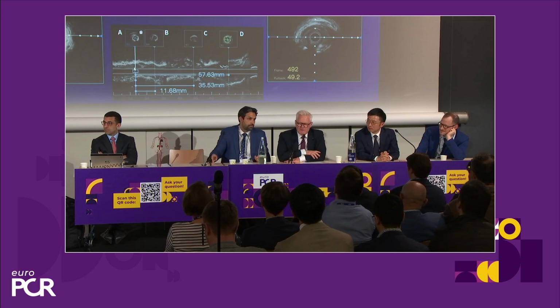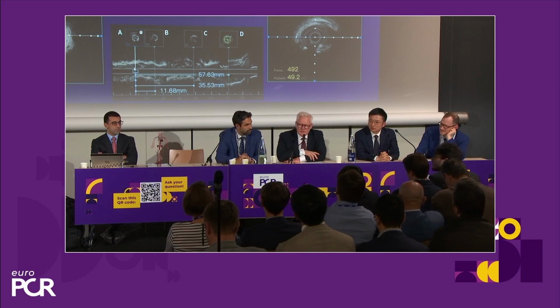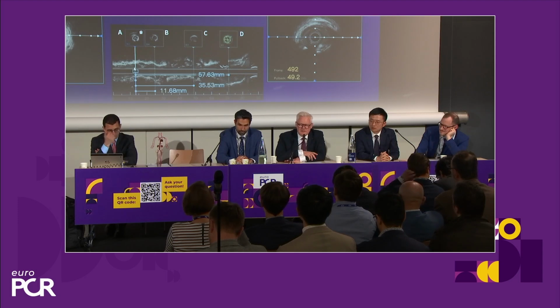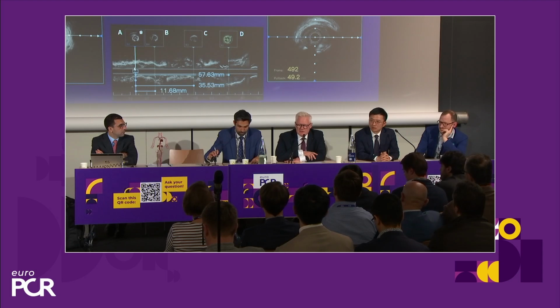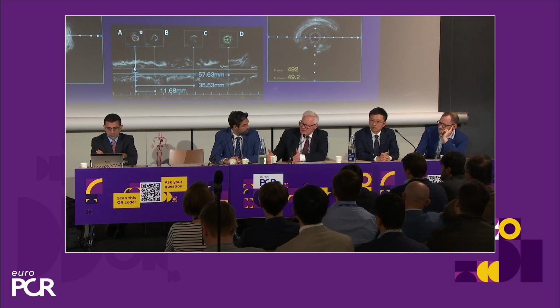I believe that if you use both, such a situation like here, where you have a discrepancy, is not so frequent. So big discrepancy because we have seen no gradient across the distal and mid part of the LAD, with both non-hyperemic and hyperemic index. So we didn't expect so much plaque burden there. And of course then it is difficult how to treat it, keeping in mind that your stent should be positioned in a relatively healthy part of the vessel. Because otherwise you increase the risk of dissection, and even if it doesn't happen, then the risk of late failure due to restenosis is of course significantly higher. So to get the optimal result of this procedure by the intravascular imaging assessment, we need to go much longer with stenting than according to physiology.